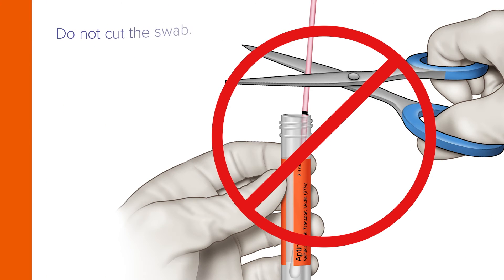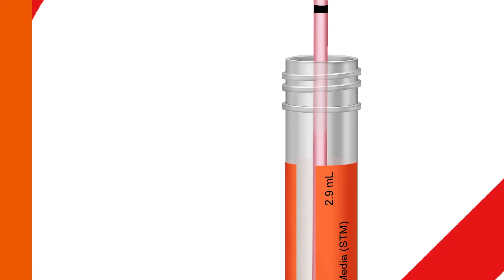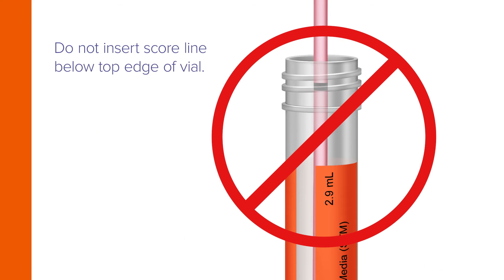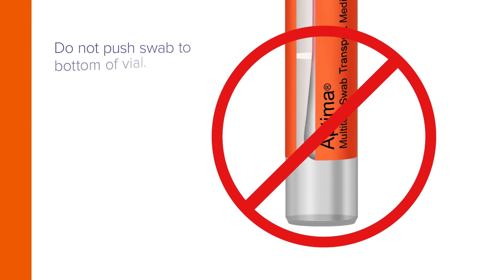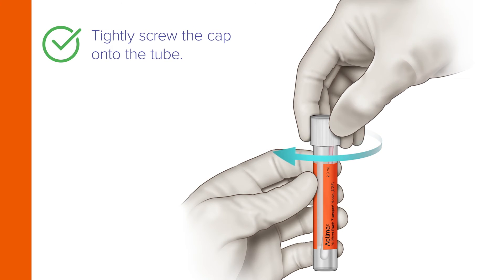Do not cut the swab. Do not fold the swab in half. Do not insert the score line below the top edge of the vial, and do not push the swab to the bottom of the vial. Now tightly screw the cap onto the tube.